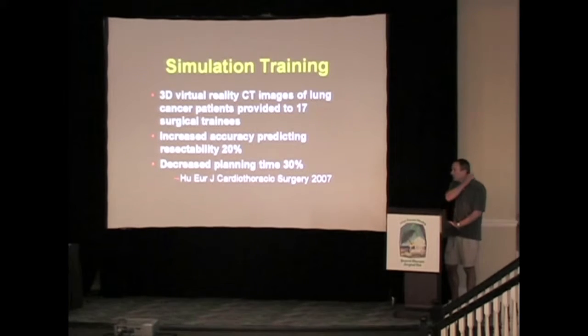I'm not going to talk much about it, but these images can also be used for simulation training. A recent study showed that in trainees, there was improved accuracy of predicting resectability and decreased planning time for surgical procedures using 3D CT.